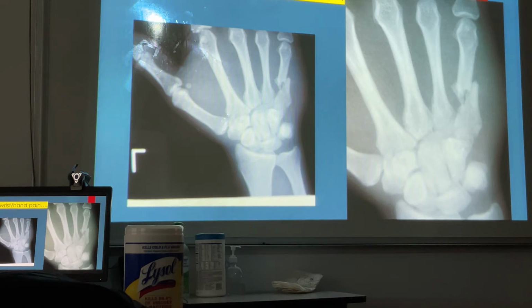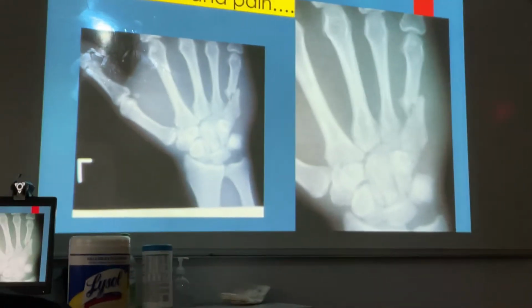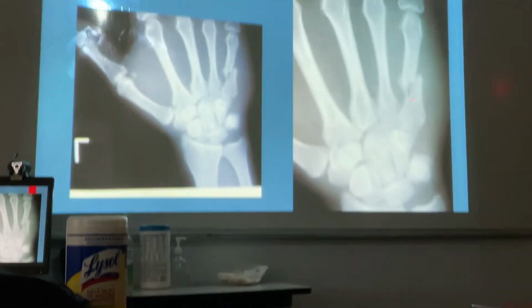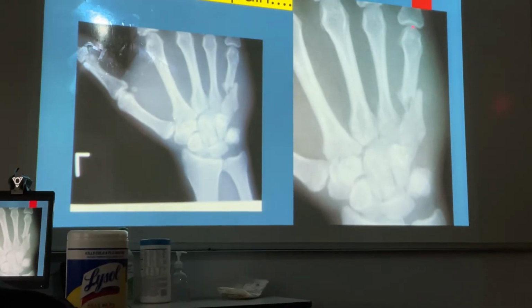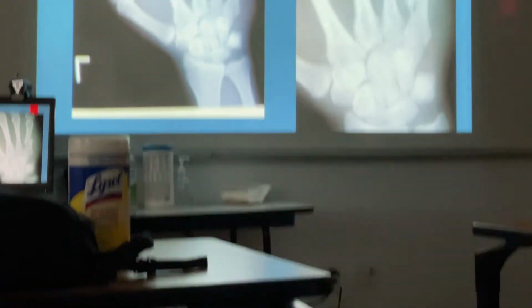But the point is, you took a wrist x-ray or a hand x-ray, if we see DIPs or ends of DIPs, okay? But then we talked about compromise to the distal or proximal joint. So if you don't get this aligned properly, and you wouldn't know that until you saw it, then someone has to make a decision how it gets treated. And then on the follow-up x-ray, if this continues not to heal well, it will ultimately affect the distal and proximal joint. And Angela did a nice job of memorializing that.